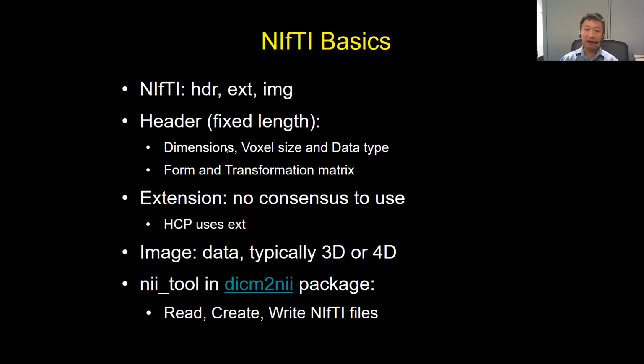Typically from the scanner the data is a 16-bit integer, but whenever we go to process, that's not enough precision. We will use a single precision float. In Matlab, the default is double precision, but single precision reduces the size by half. So that's why most packages use single precision.